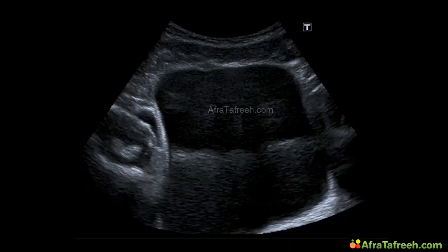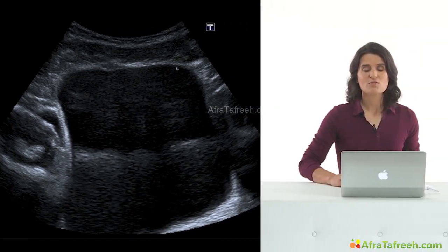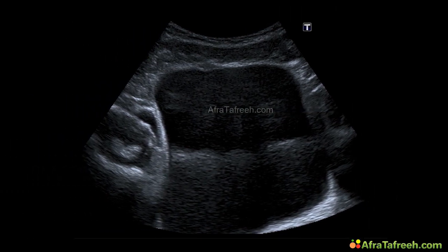So here, let's see a picture. We got the urinary bladder over here, filled with urine, and it's really, really full. It's a large amount of fluid in it. It was about, I remember, 500 or 600 milliliters. And the patient did not really have an urge to void. And he also complained about lower abdominal pain. And of course, the problem of the patient had to be solved and he needed a urinary catheter.